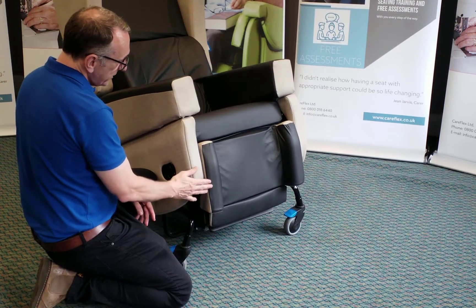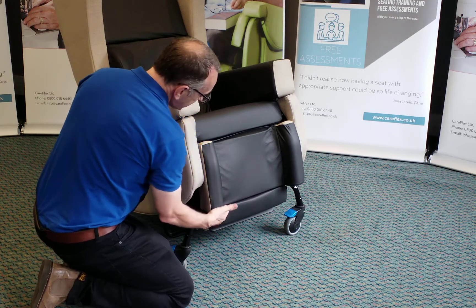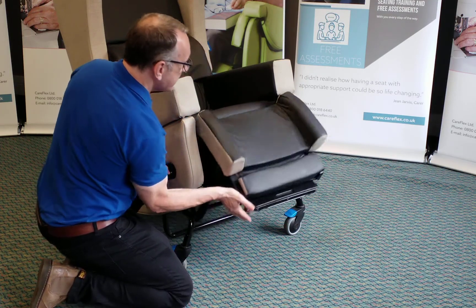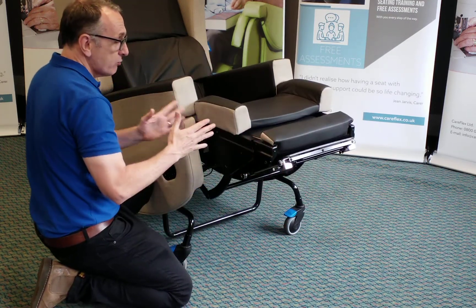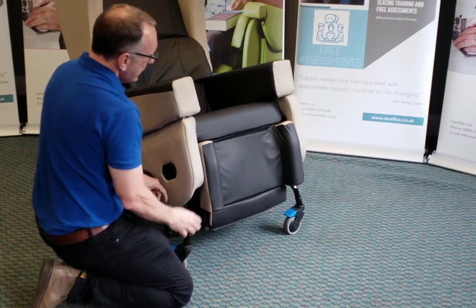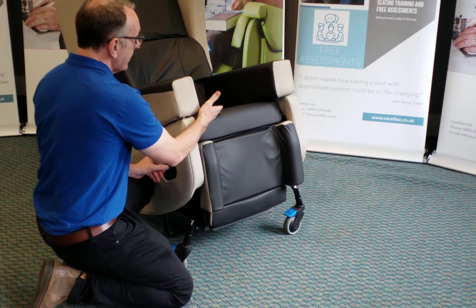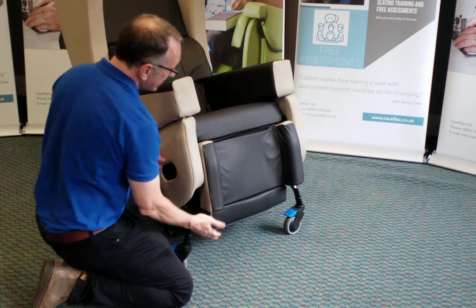If we look at the foot plate, the leg rest, and the smart seat in a bit more detail, you'll see that when I elevate the leg rest, it articulates — that is, it grows in length. That feature will help maintain contact between the client's leg and the seat surface when we elevate the leg rest.